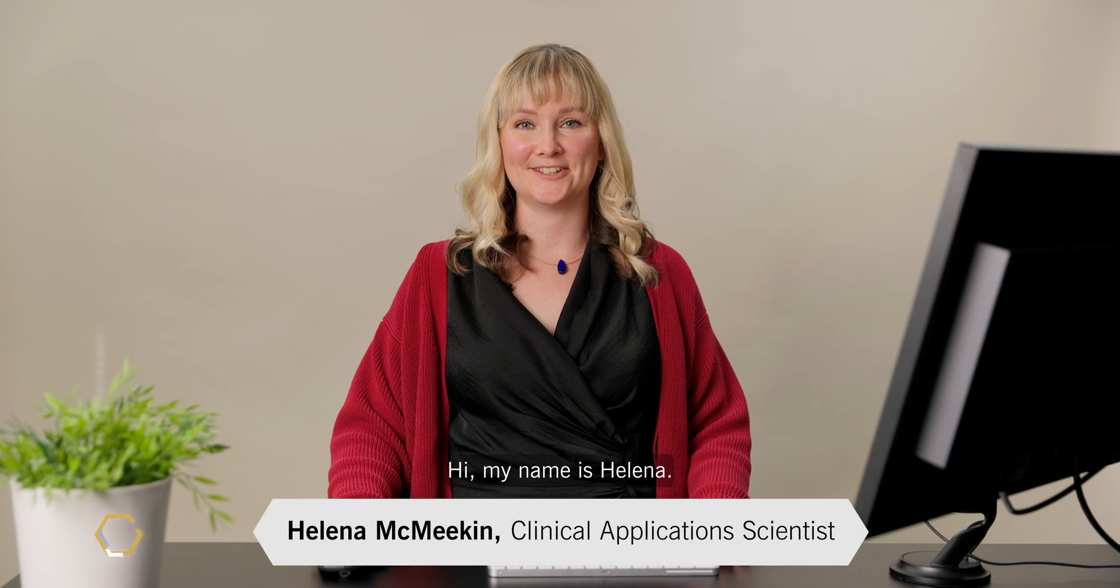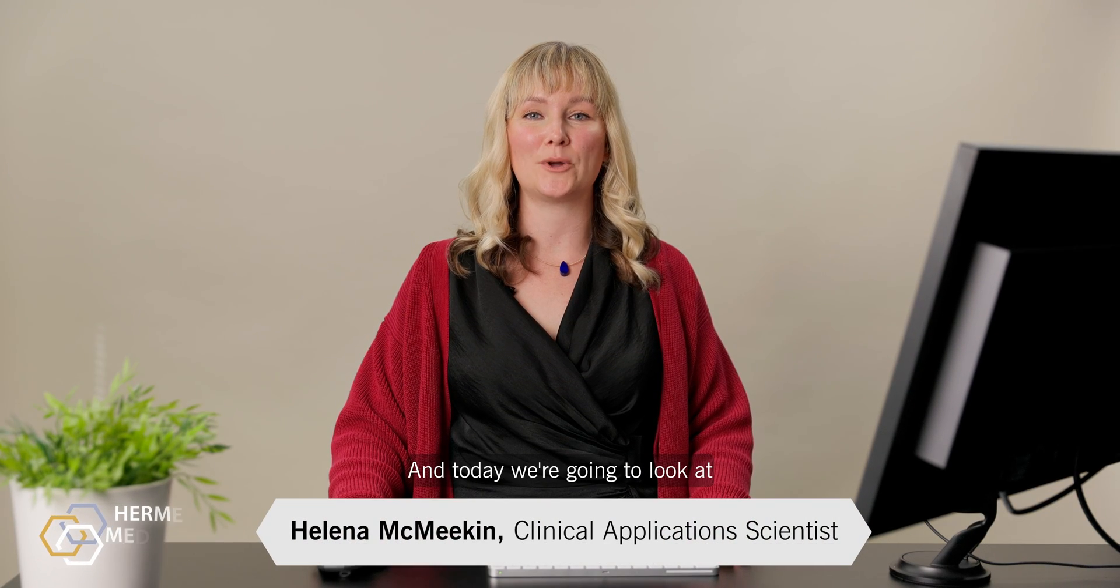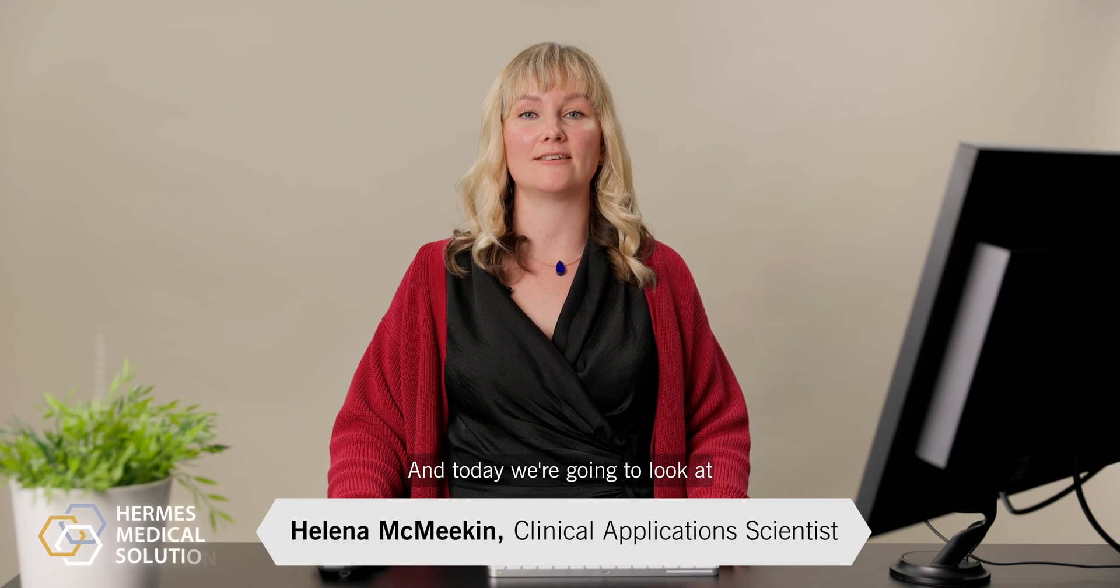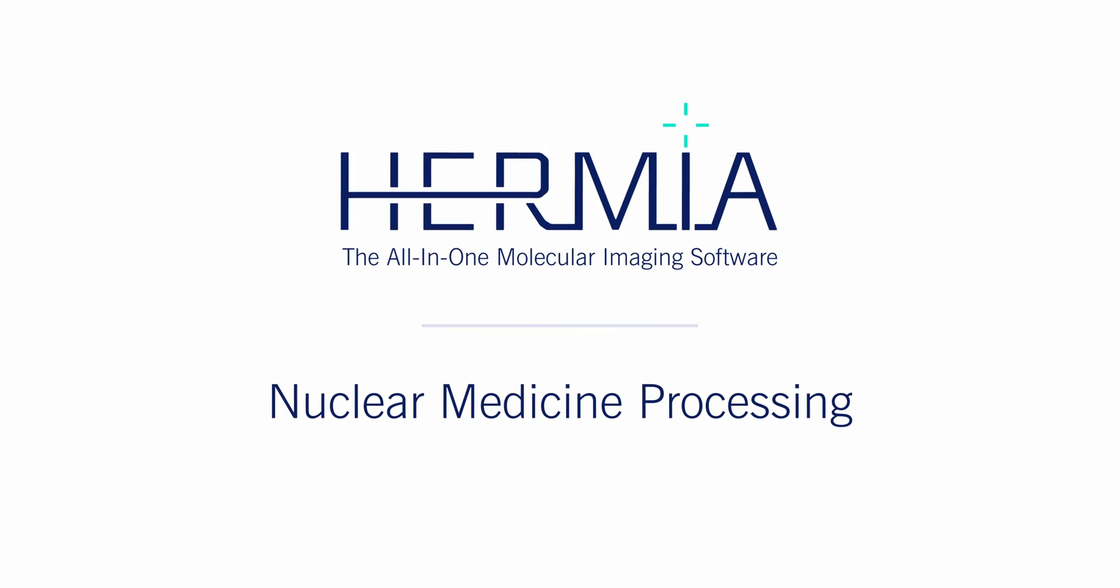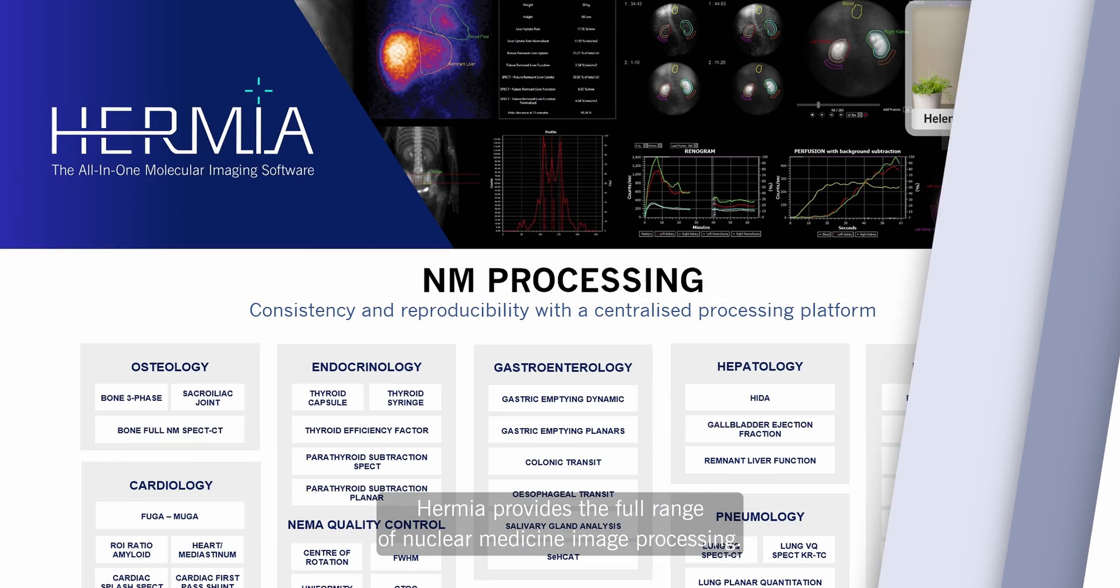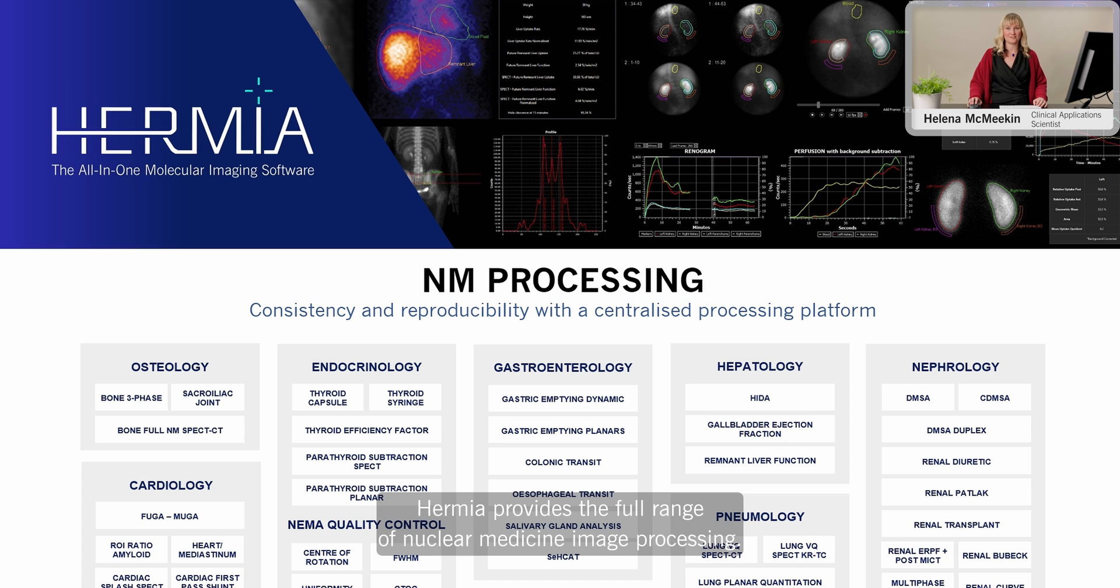Hi, my name is Helena, and today we're going to look at the Hermia nuclear medicine processing suite. Hermia provides the full range of nuclear medicine image processing.